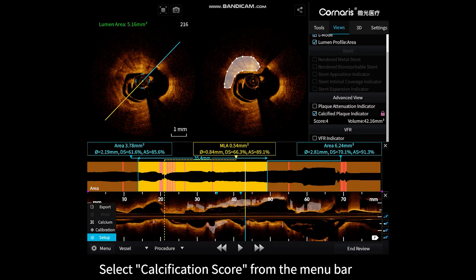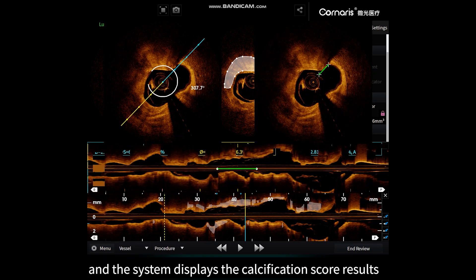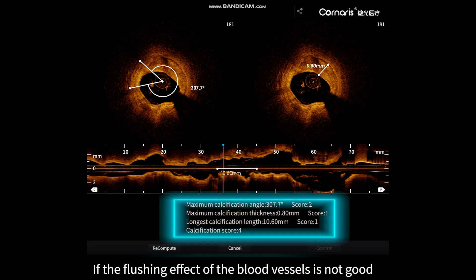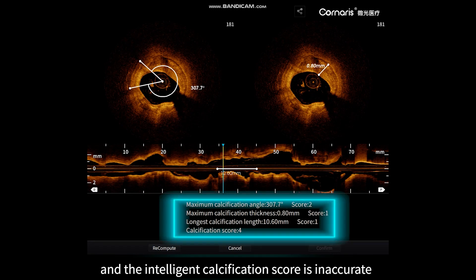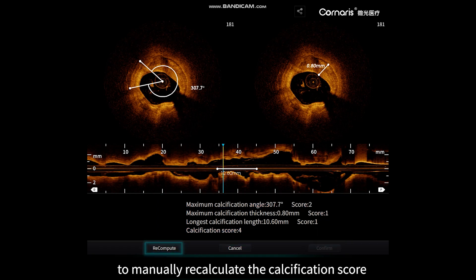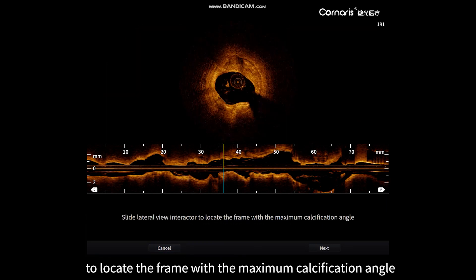Select Calcification Score from the menu bar and the system displays the calcification score results. If the flushing effect of the blood vessels is not good and the intelligent calcification score is inaccurate, the system provides a manual mode to manually recalculate the calcification score. Step one: slide the long axis control line to locate the frame with the maximum calcification angle.